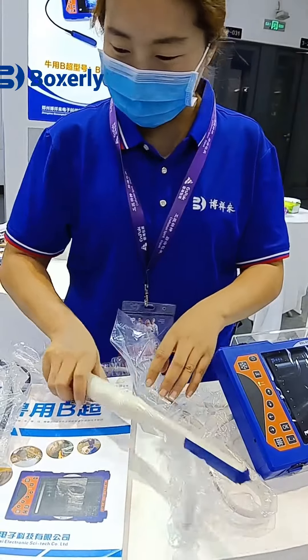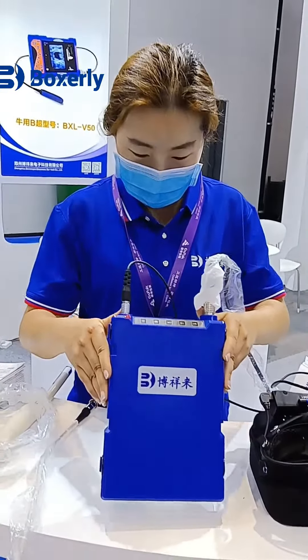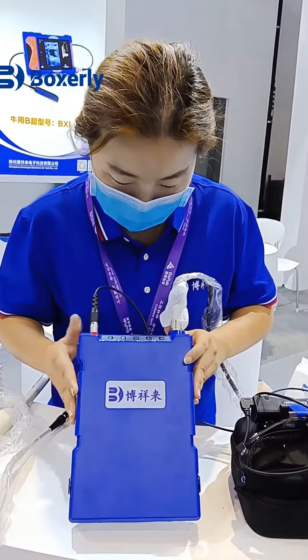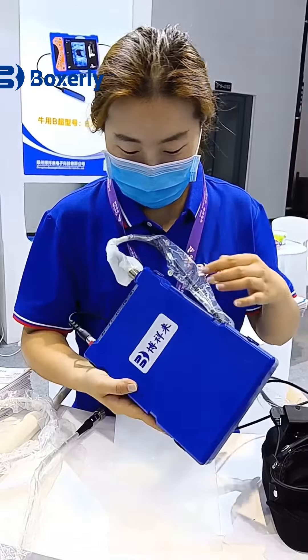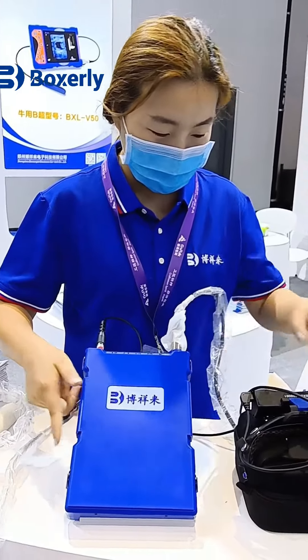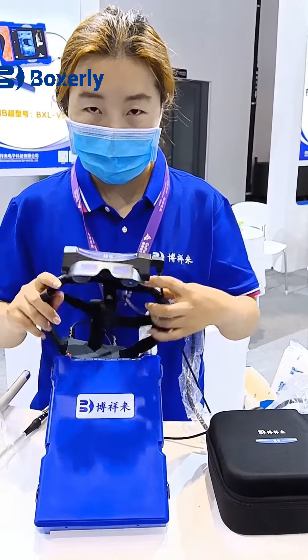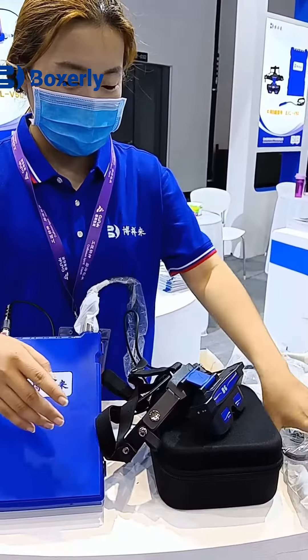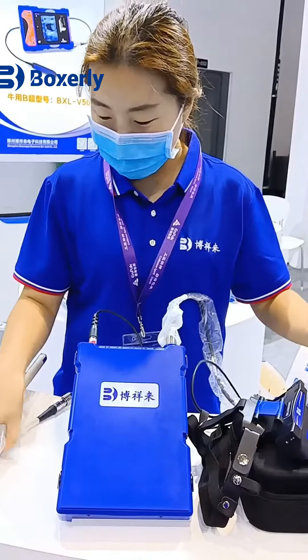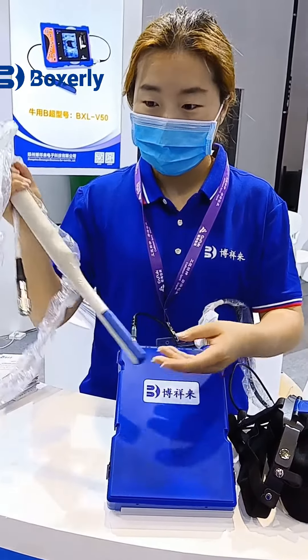The BXLV60 is built on the basis of the BXLV50. This machine has higher definition image quality and larger storage space, and is equipped with B6 type 2D/3D switchable video glasses. It can also be equipped with a back fat probe, so in addition to meeting the requirements of animal pregnancy and uterine disease detection, it can also detect fetal sex and back fat, making it suitable for large farms.